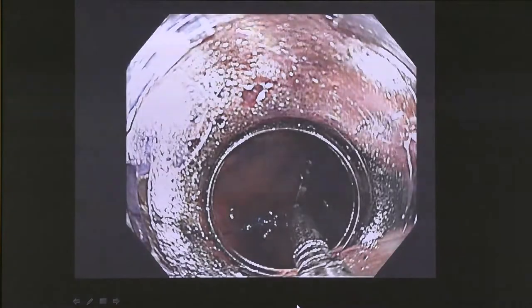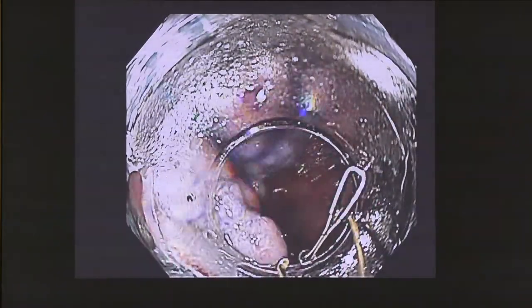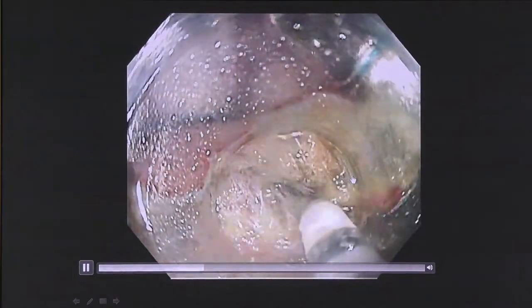Yeah, this is the clip with line. And you shoot the clip at the end of the lesion. After that, you can have a good visualization of the submucosal layer, although there was much fat at the submucosal layer. This yellow substance is rich fat. But the dissection was rather smooth because there is the clip, so the traction by the line makes it easy.